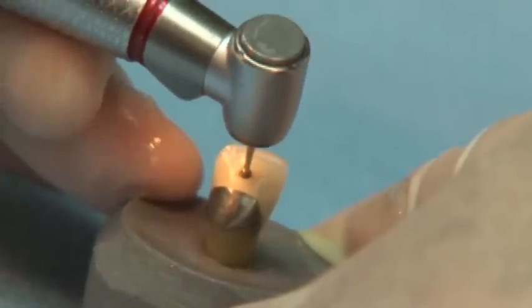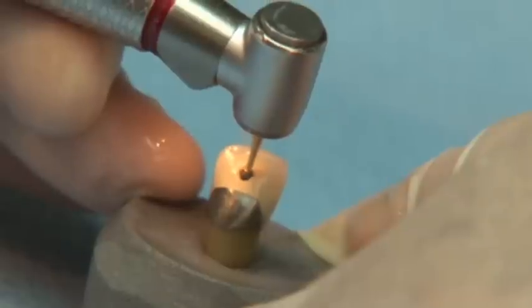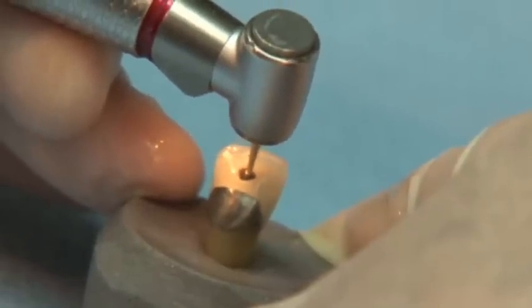Look at how smoothly and efficiently the Great White number 6 round burr goes through both the porcelain and metal of this failed crown.